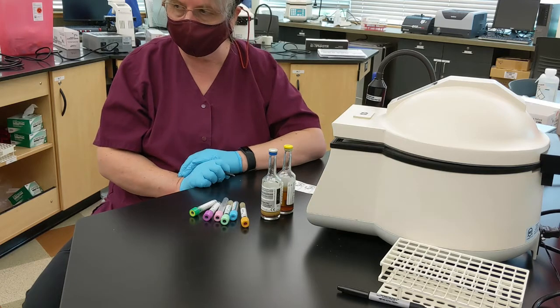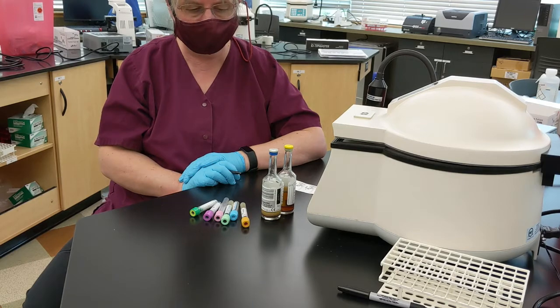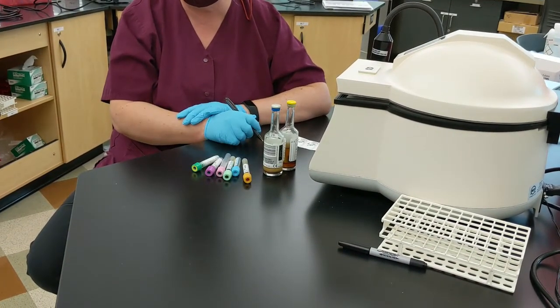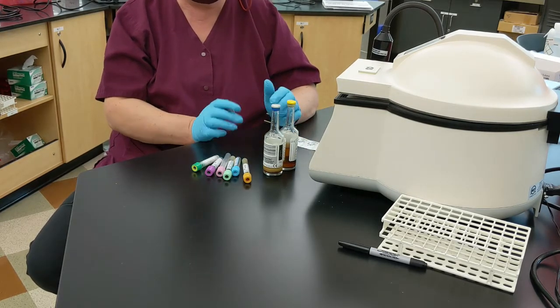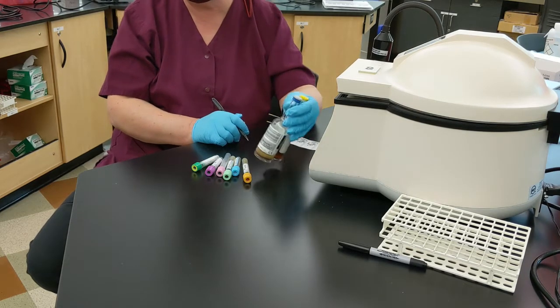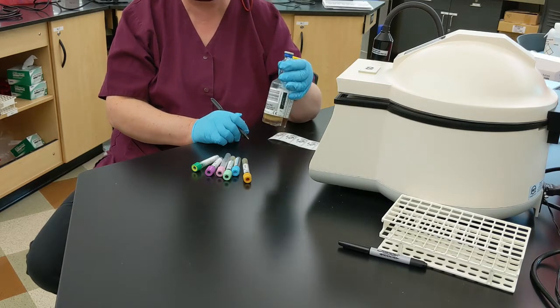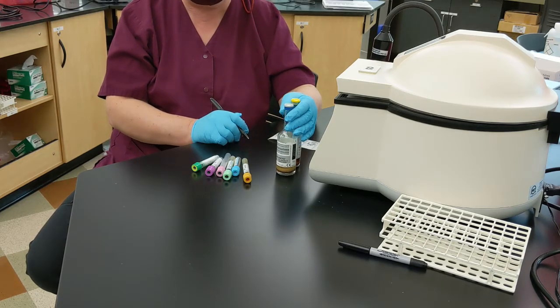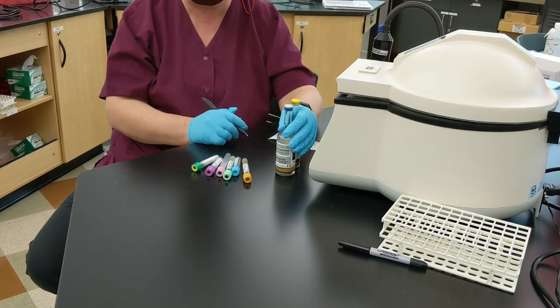If blood cultures were ordered, that's a little bit different. You need to be sure you aseptically prepare that site because we don't want to have contamination from the skin. They would go first. Most of the time, we don't do a lot of blood cultures unless the patient has a fever and they want to rule out that they're not septic, that they don't have something growing in their blood.